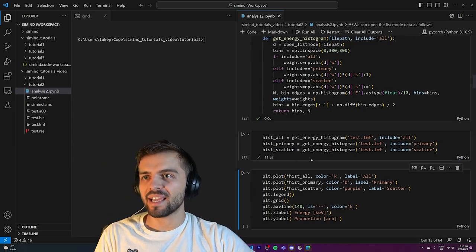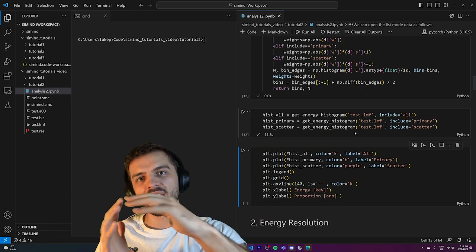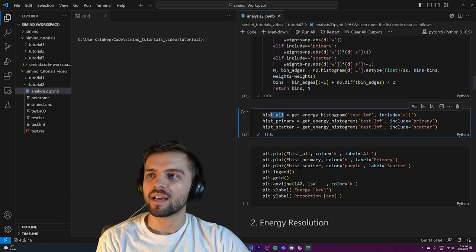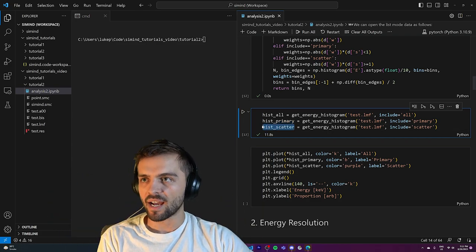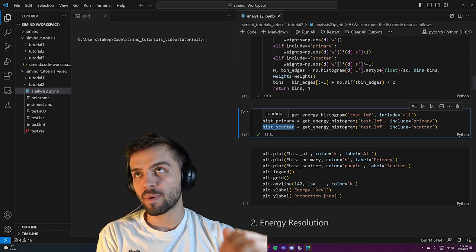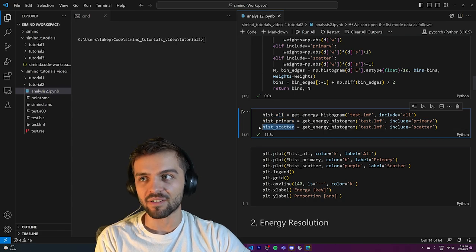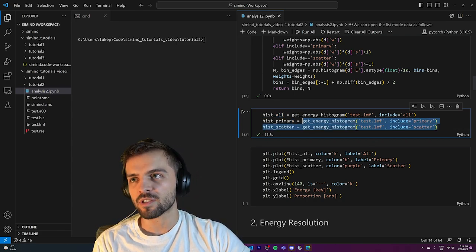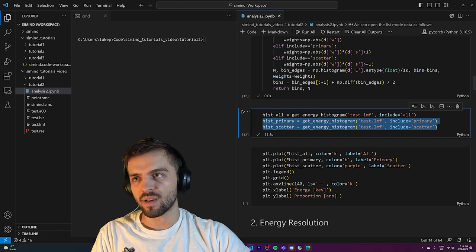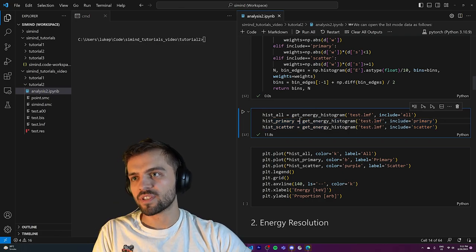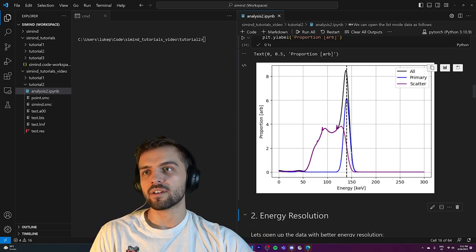This code took about 11.8 seconds to run — we've simulated 50 million photons, some scattered and some going right into the detector. I have my spectrum of all photons, primary ones, and scattered ones. Another important thing: in real SPECT systems, you can't differentiate between primary and scattered photons like we're doing here. The only way we can do that is because we've run a Monte Carlo simulation where we can track each individual photon.